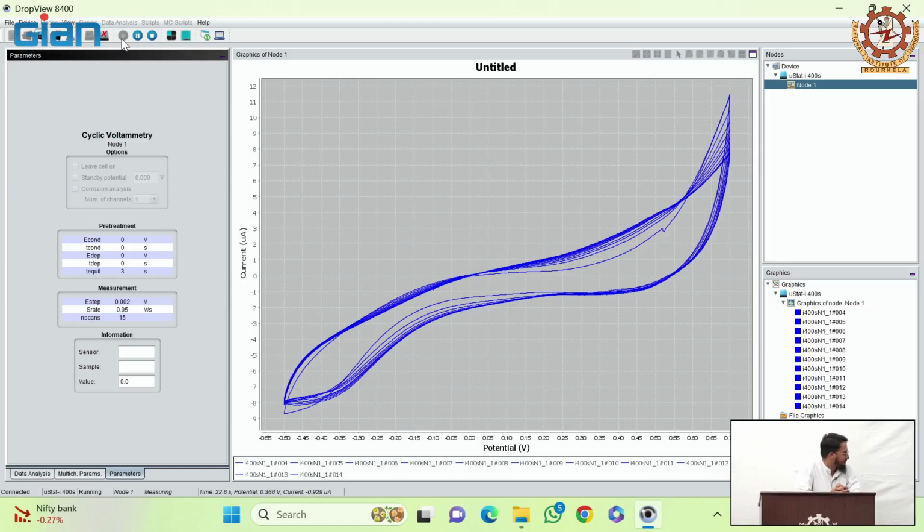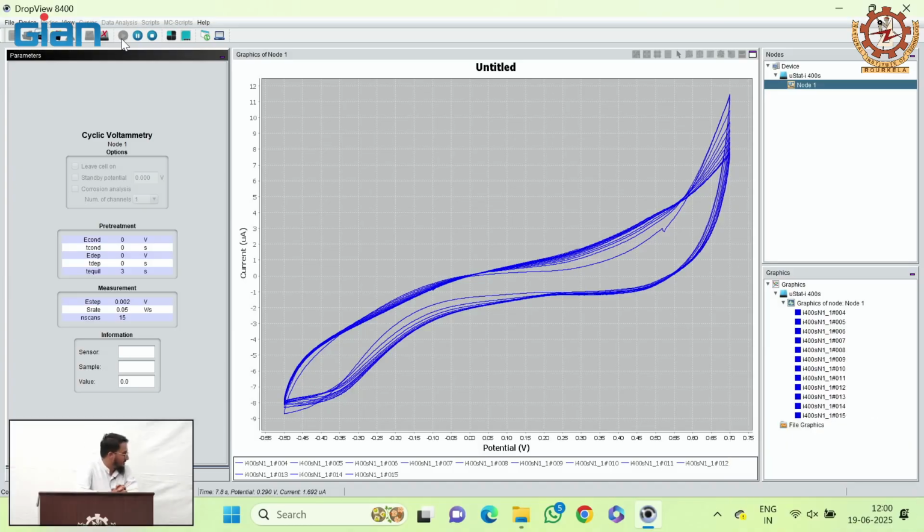One more scan remaining. So, as you can see at the bottom of the screen towards the left hand side, the time is reducing as the scan is progressing. You can see the change in time and voltages and current, and they are making the CV curve. And you can also see the different scans. So, each legend at the bottom is one scan, one line is one scan. So, we have 15 scans, probably this is the last scan, I guess. Three more scans. I haven't counted.